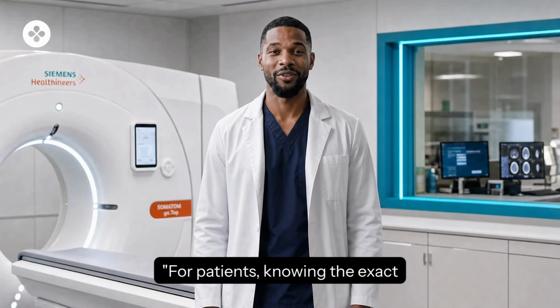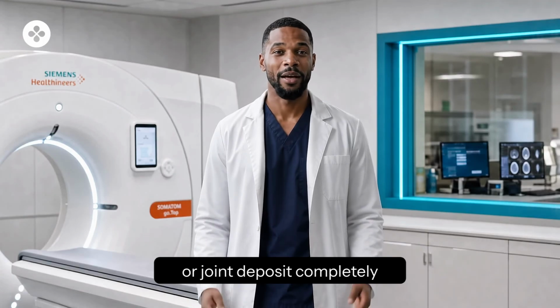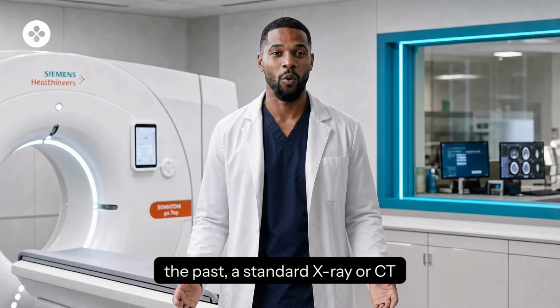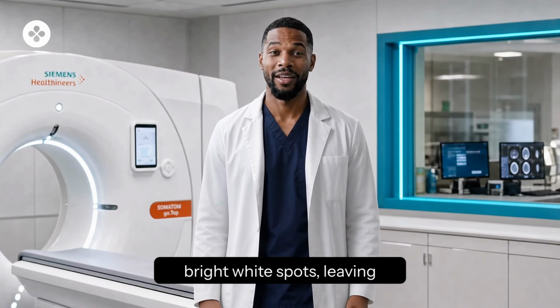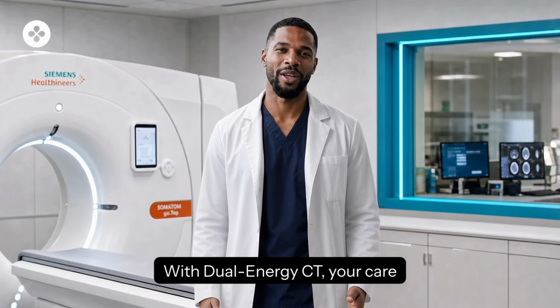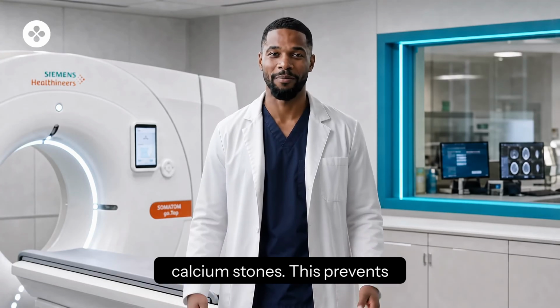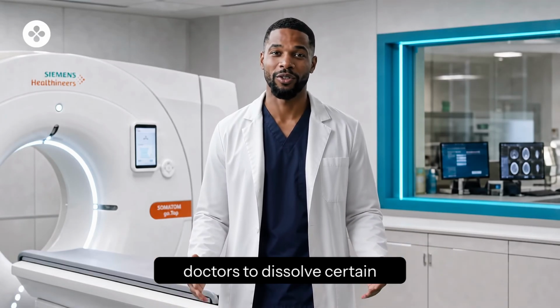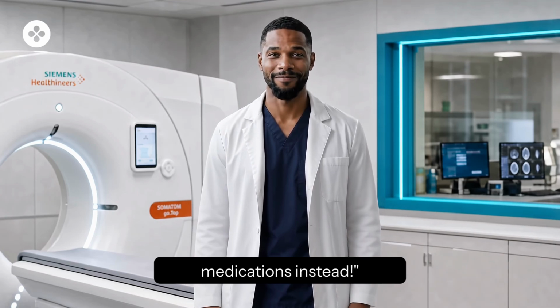For patients, knowing the exact chemical composition of a stone or joint deposit completely changes your treatment plan. In the past, a standard X-ray or CT scan showed all kidney stones as bright white spots, leaving doctors to guess their makeup. With dual energy CT, your care team can instantly distinguish uric acid stones from dense calcium stones. This prevents unnecessary surgeries, allowing doctors to dissolve certain stones using targeted medications instead.